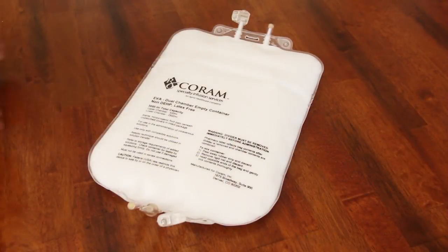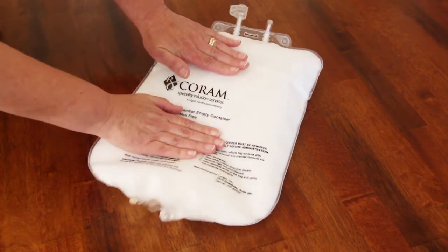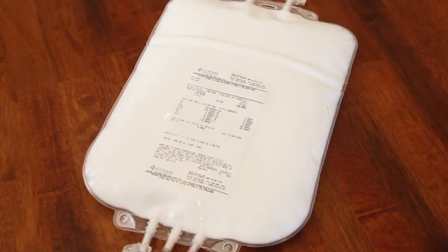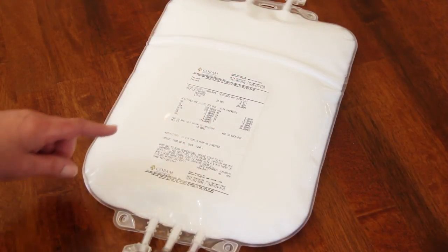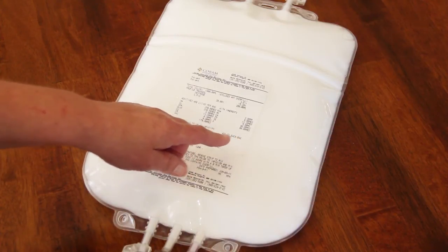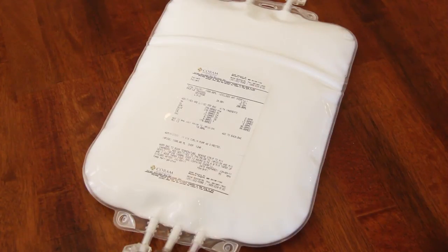Gently knead the bag back and forth to help mix the lipids with the solution. Your physician may have ordered multivitamins or other medications that need to be added to the TPN bag prior to the start of your infusion. Instructions on how to add multivitamins and other medications to your TPN bag are available in separate tutorials.